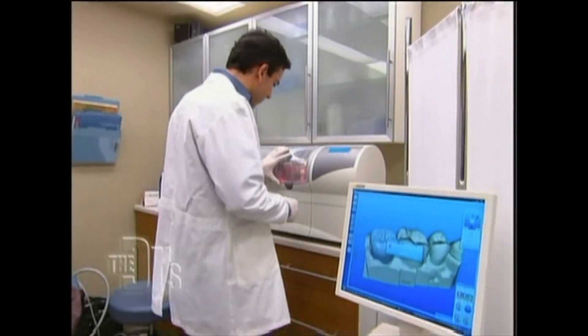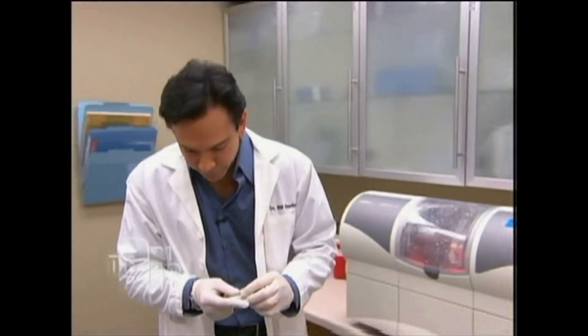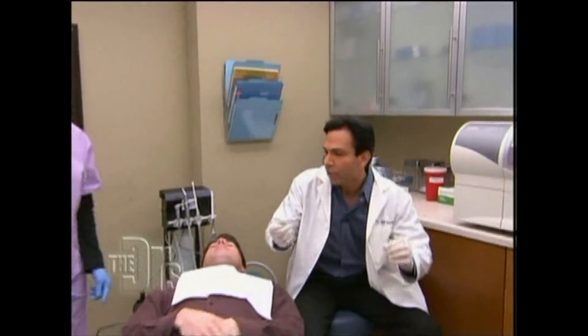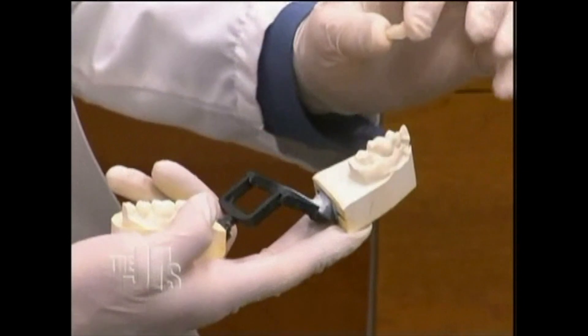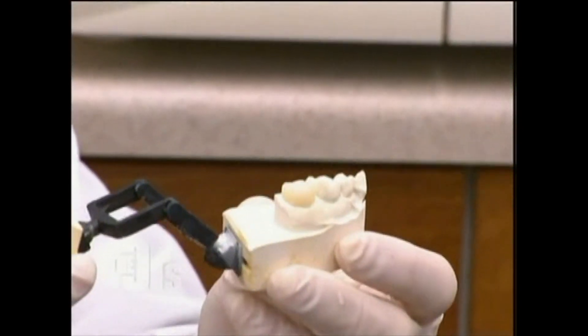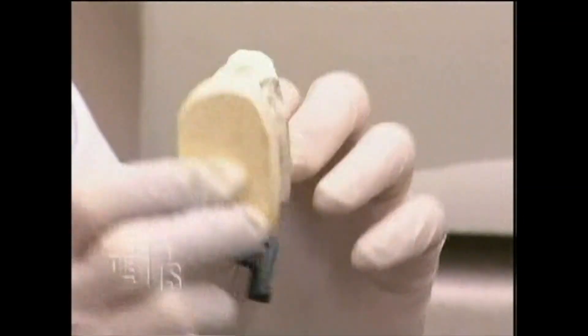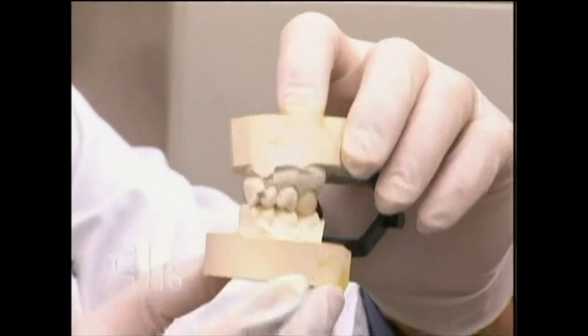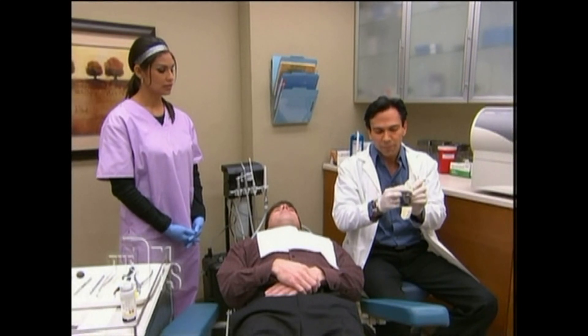All right, there we go. And do you think this technology will be available in a lot of dentists' offices? It's starting to become more and more popular. Here's the crown now. Can I have the model, Krista? Let me show you how this works. So this is a replica of Kevin's mouth. Here's the porcelain crown that we just made. You'll see that this crown fits right on the margin, right on the model, and it is actually a perfect replica of what Kevin's tooth was before.